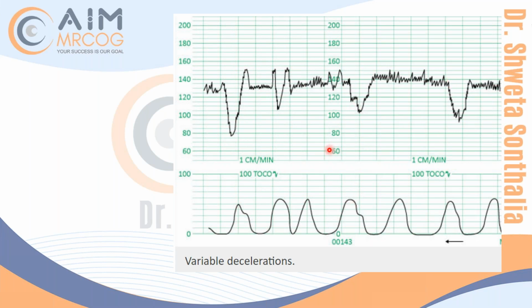So what else? Because there are concerning features, ma'am. No, I'm not talking about concerning features. Yes, there are concerning features here, but in early deceleration, anyways, there will be no shouldering. The shape is, I'm thinking, early. The sudden drop, yes, you're right. It's starting sometime before the contraction and ending after the contraction, right?